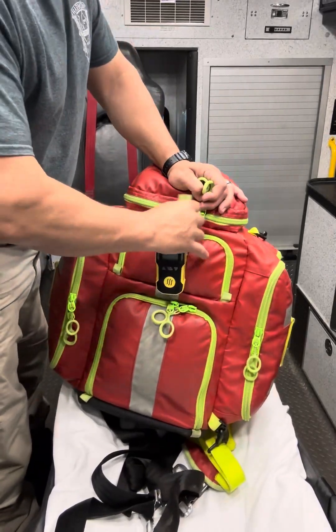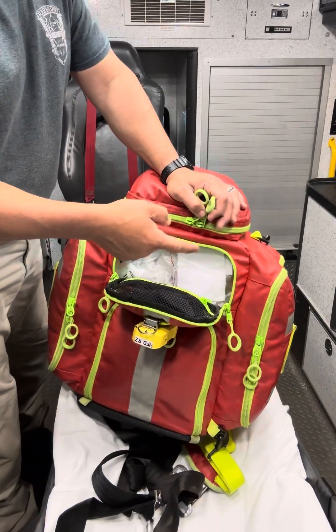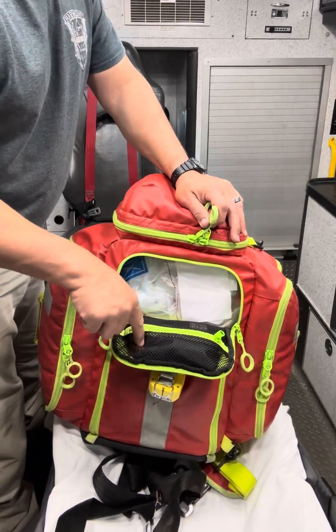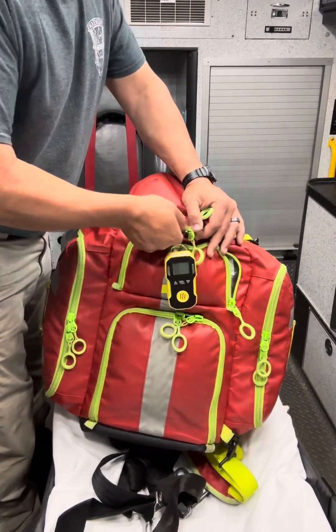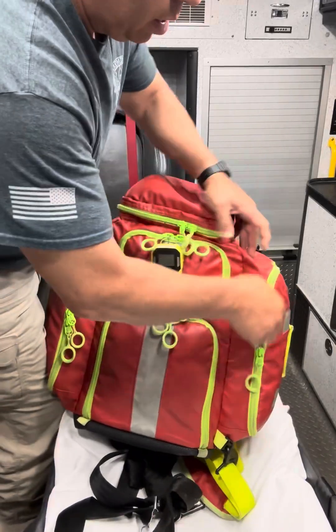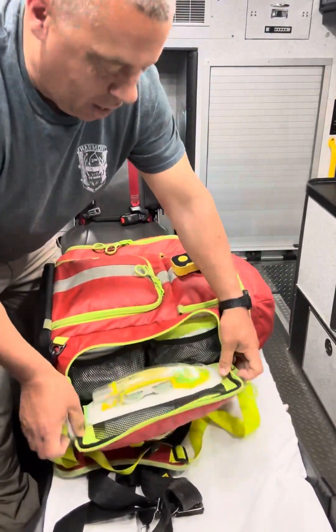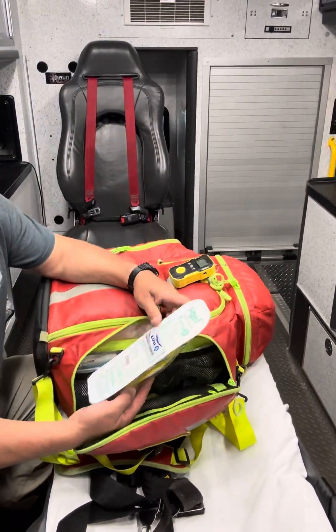In this compartment, we're going to have our BVM and two CPAPs — large and small, and medium. We have a blood pressure cuff in the small mesh portion of the compartment. On the side, we can't fit all of the i-gels into one side, so we have them one on one side and two on the other.